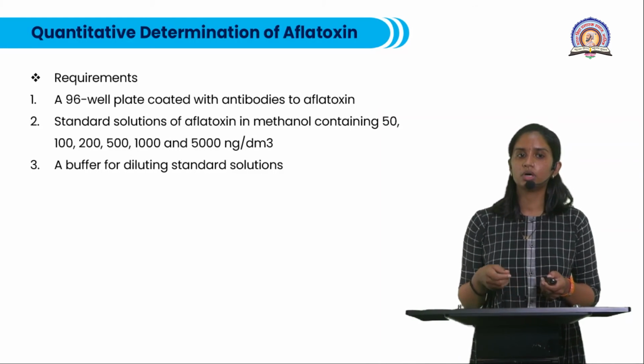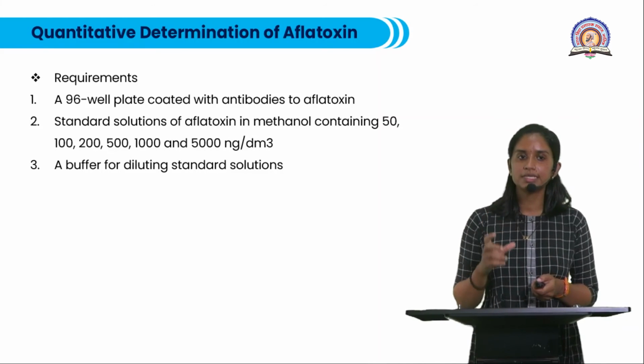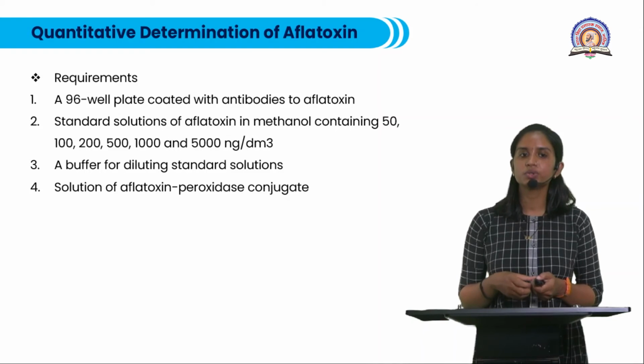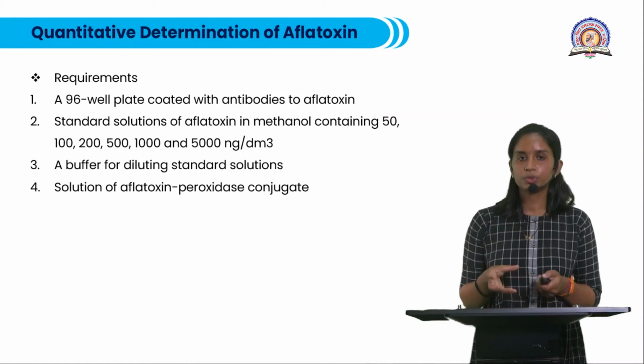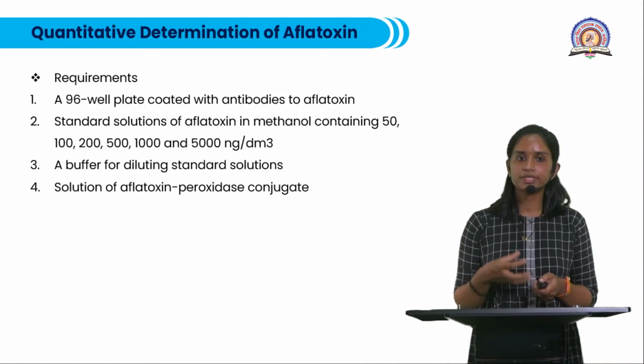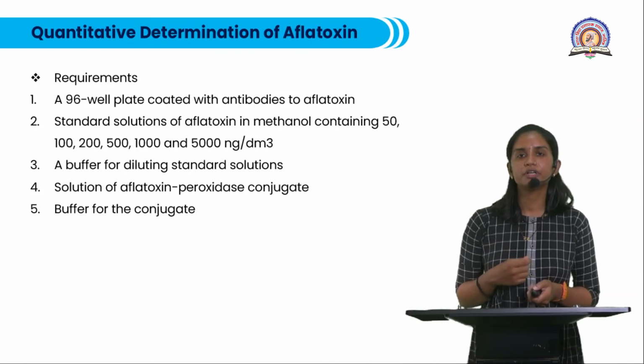You are going to use buffer to maintain the integrity of the solution and to make it stable. Then next is solution of aflatoxin and peroxidase conjugate. So pure aflatoxin will be attached to enzyme molecule, that is peroxidase here. Then you need buffer for the conjugate.